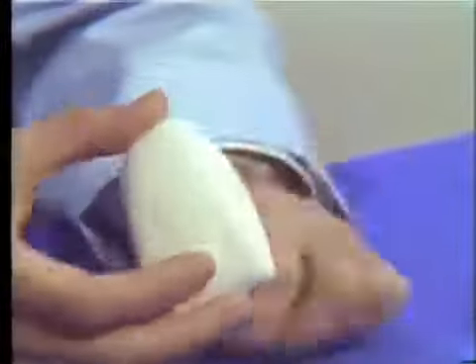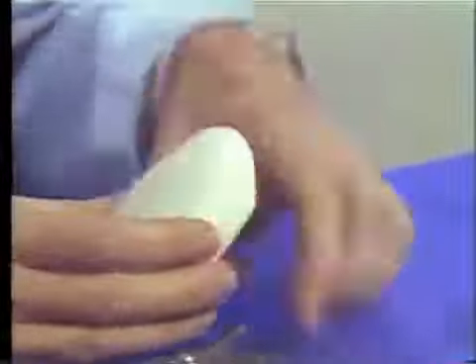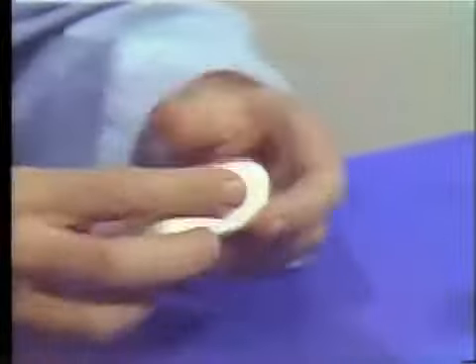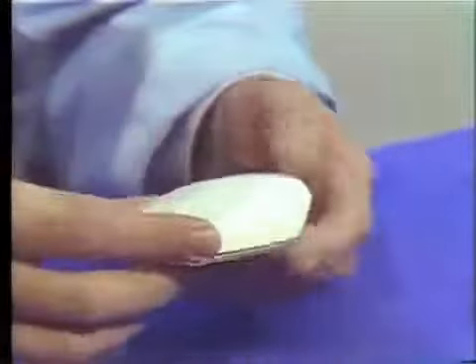The facing itself can be ground on the incisal, on the proximals here, and on the labial to contour it, and so on, and the backing is then trimmed to exactly match the facing after that's done. The one area that cannot be ground, of course, is this fitting surface here, which goes against the Steele's backing.